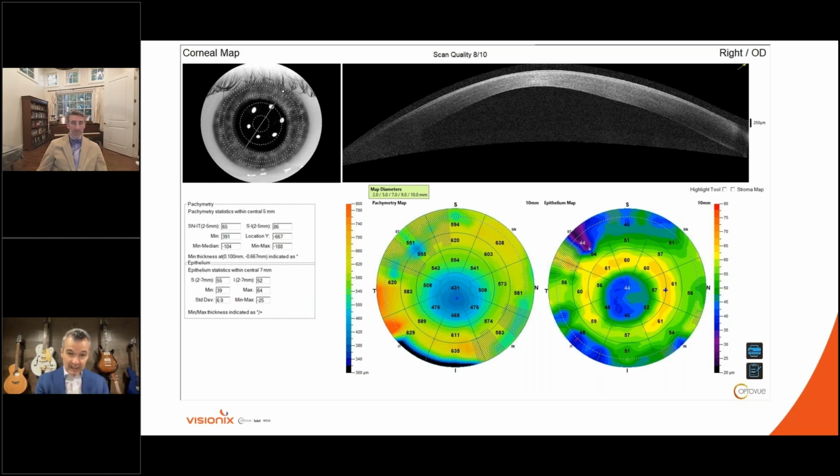because some people online tonight have the Solix, so we'll understand these scans, and some people do not have a Solix. So I want to go over the basis around what you're looking at here. So on the top left, and you'll see a lot of these scans have similarities, but on the top left, you can actually see what's physically being scanned here, and that's the front of the eye. And all of these radial scans right here represent different radii of the scans that are being created. And what you're looking at is a 10 mm total scan of the cornea.